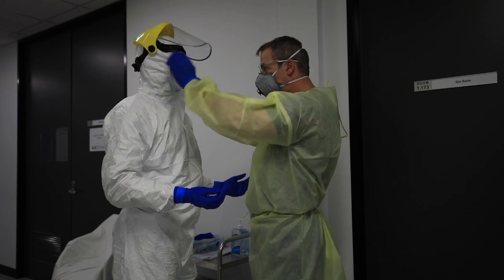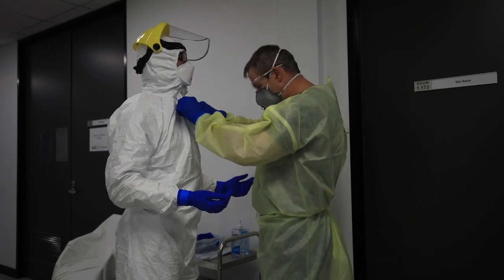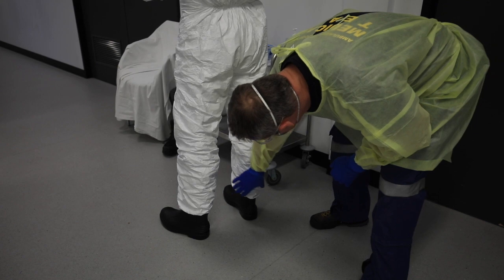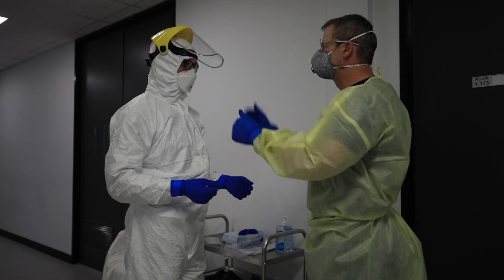Now I can present for my body check. Doing the body check: no gap to the ear, good seal, coverage on the mask, zipper is up, cover around, gloves over your cuffs, legs are down, boots are covered. Body checks are good.